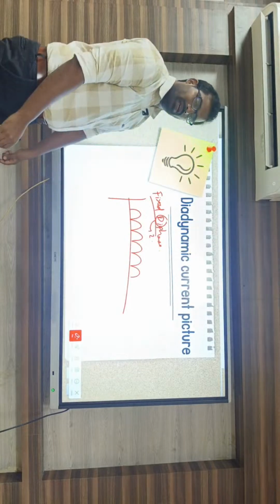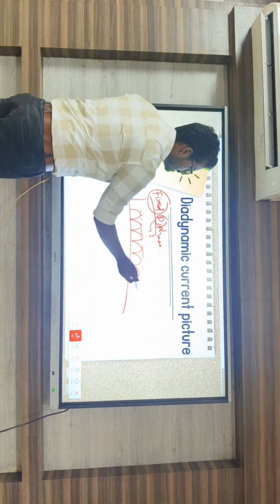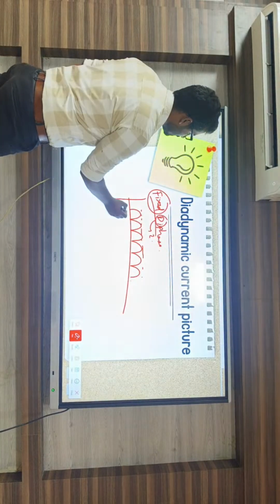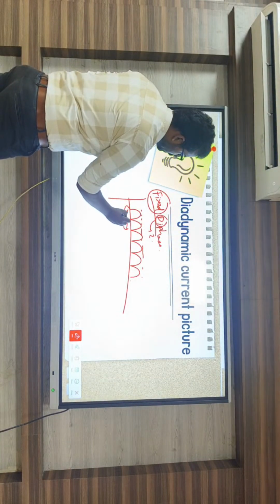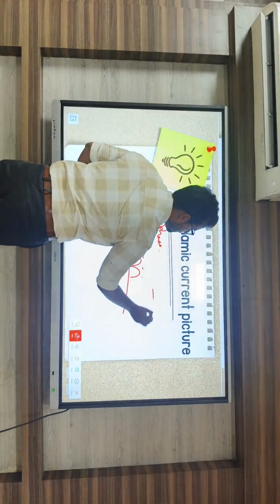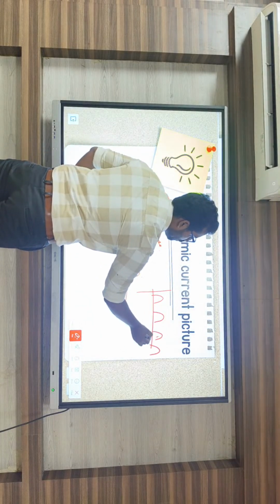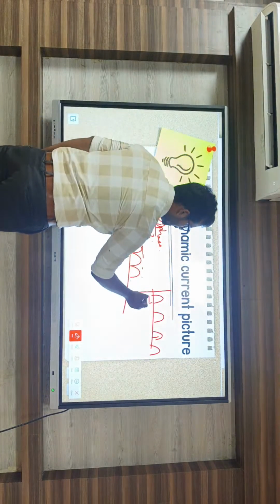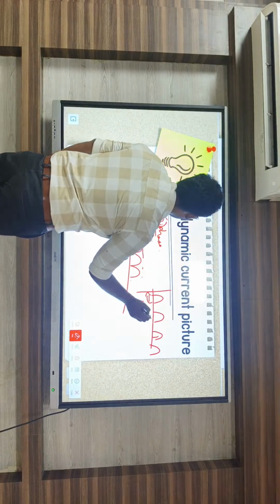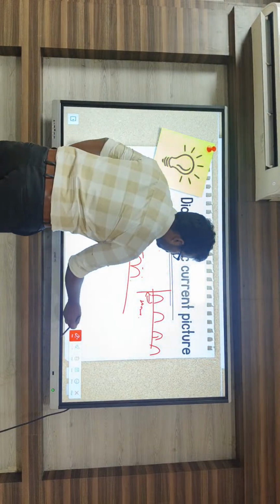So this is the diphase, and again the frequency levels are fixed, depending upon the patient's tolerance level. The time duration is 10 milliseconds. So this is the fixed diphase and this is the fixed monophase. The monophase time is 10 milliseconds and the diphase's pulse duration is also 10 milliseconds.